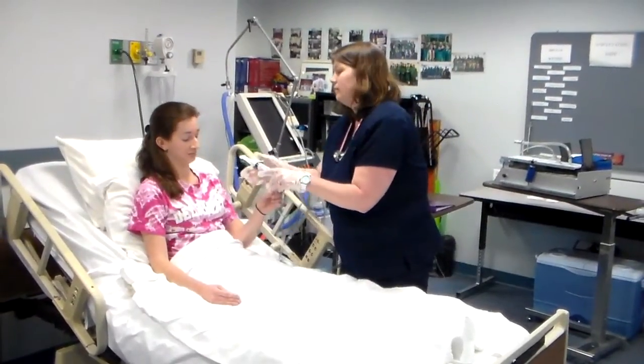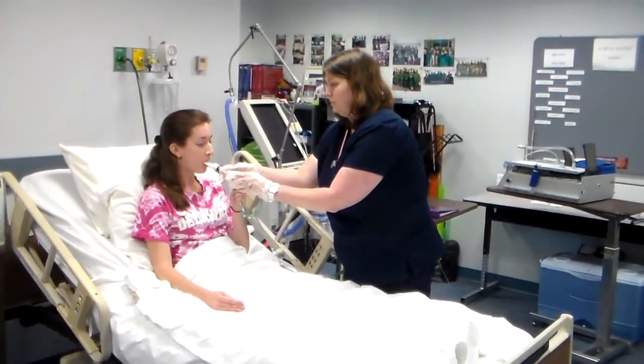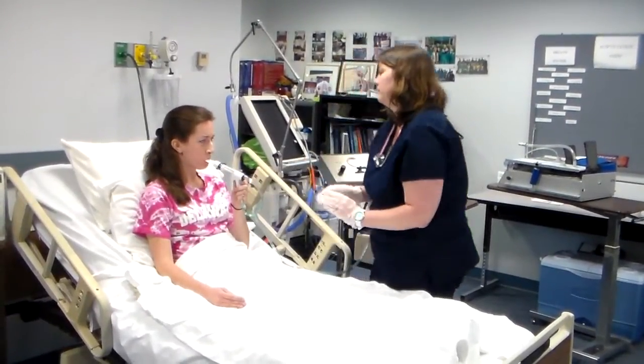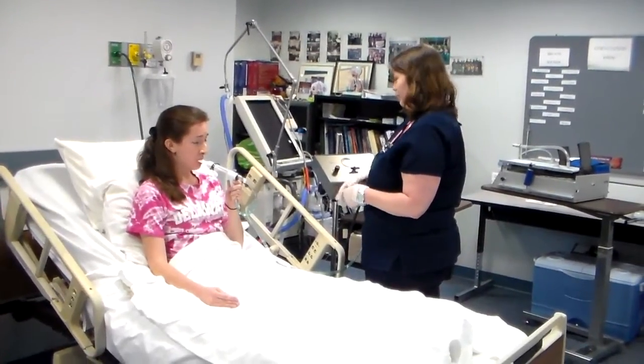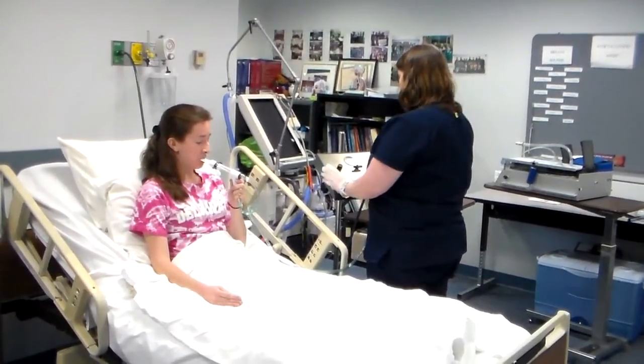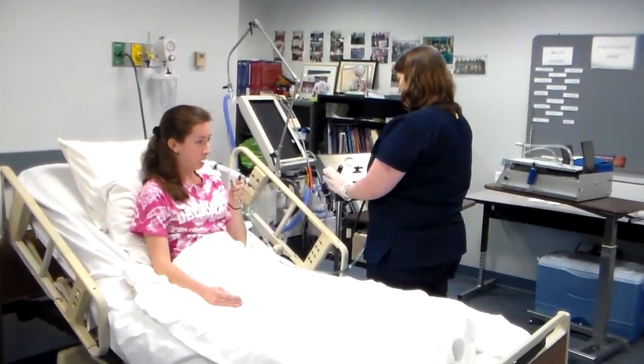Attach the mouthpiece and instruct the patient to make a tight seal around the mouthpiece and keep their cheeks tight. The patient should begin breathing normally through the mouthpiece. Encourage a slow exhalation of 3 to 4 seconds.